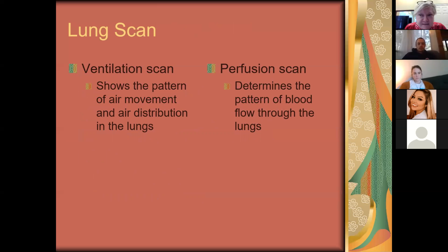It is a nuclear medicine scan. And so what they'll do is you'll go down to nuclear medicine and you will breathe a radioisotope. So, they'll pinch your nose, they'll put a spirometer in your mouth, you'll breathe in this isotope, and then they will put the scanner down and they will scan your lungs. And they will make sure that this isotope went through all your lungs and that you didn't have like a tumor or something that didn't let your lungs show up. And then after that, if your lungs look good, they will then inject this radioisotope. It's not a dye. It's not an iodine-based dye. It's just a radioisotope. They'll inject it, and then they'll watch it go through your lungs.